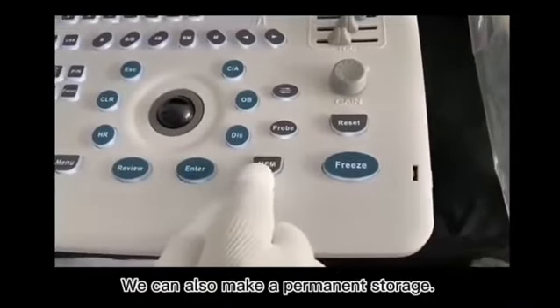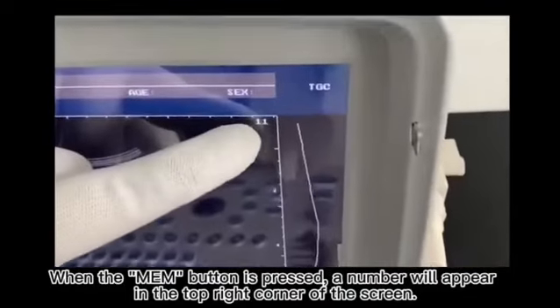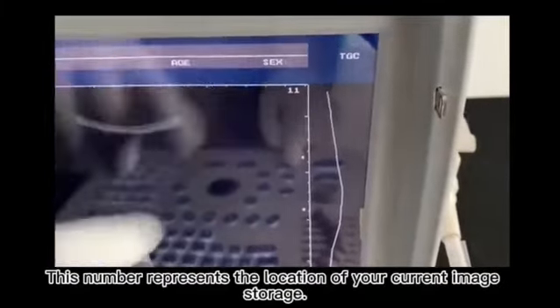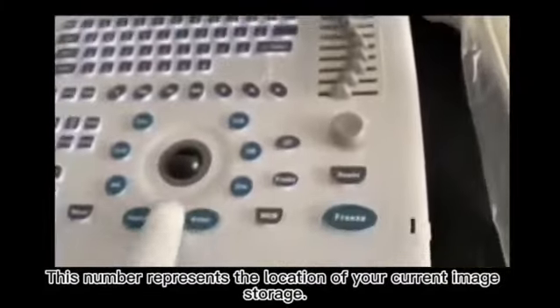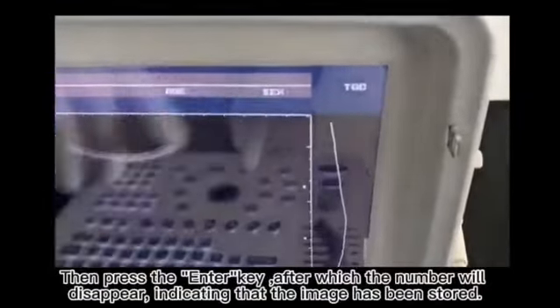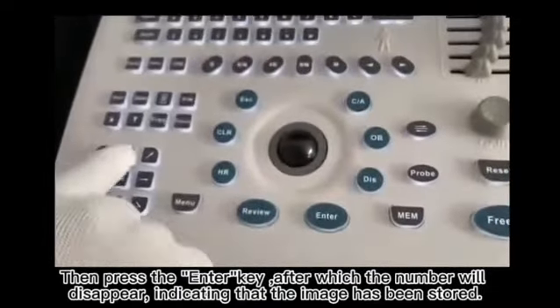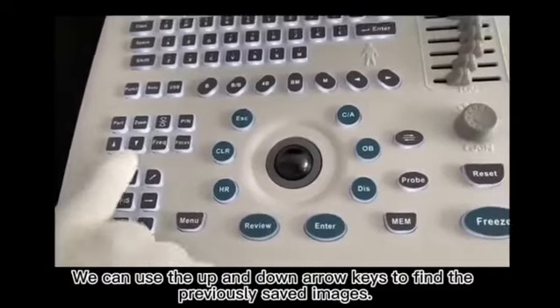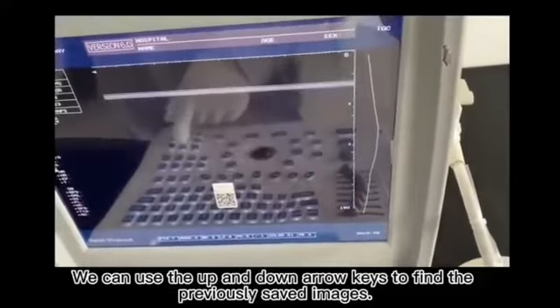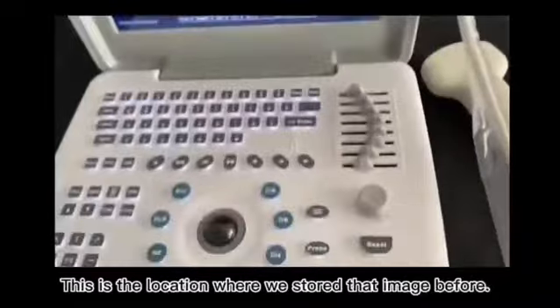We can also make a permanent storage. When the memory button is pressed, a number will appear in the top right corner of the screen. This number represents the location of your current image storage. Then press the Enter key, after which the number will disappear, indicating that the image has been stored. We can use the up and down arrow keys to find the previously saved images. This is the location where we stored that image before.